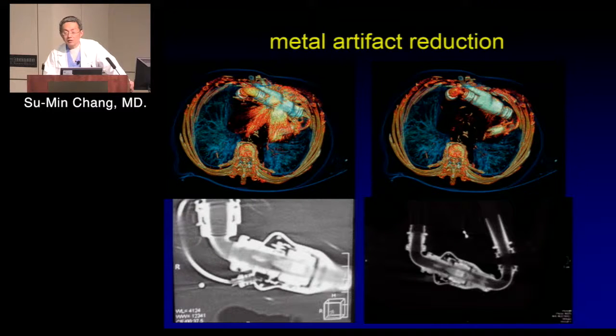I would be interested, and what I want to ask Jerry about, is when they exchange the pump, when they say there's a pump thrombosis, how do they make the diagnosis? I mean, is that a small clot? Or? Yeah, absolutely. Okay, that's helpful. So at least we have a decent gold standard.